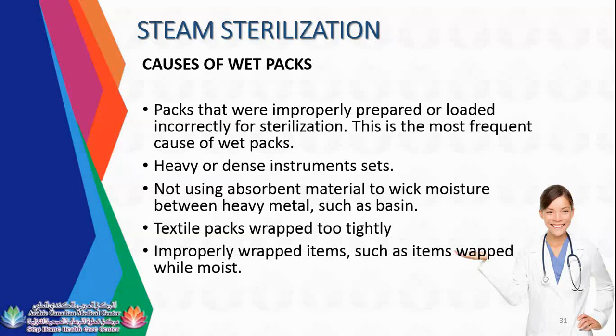Textile packs wrapped too tightly. Also, improperly wrapped items, such as items wrapped while moist. When you are pouching instruments, you need to pouch them once they are totally dry, not seal them with moisture, or wet and then pouch them directly because you don't have time.